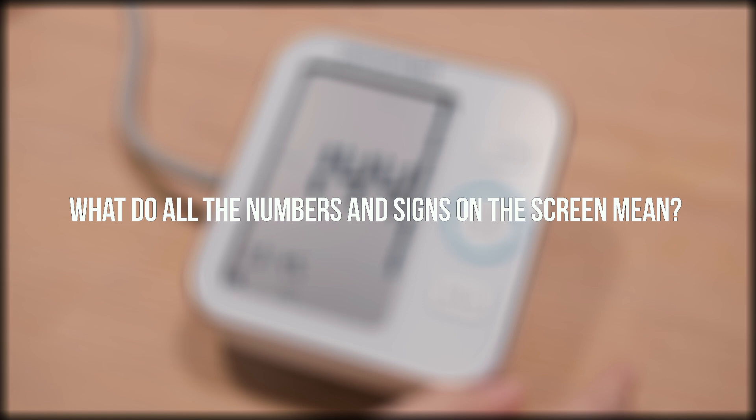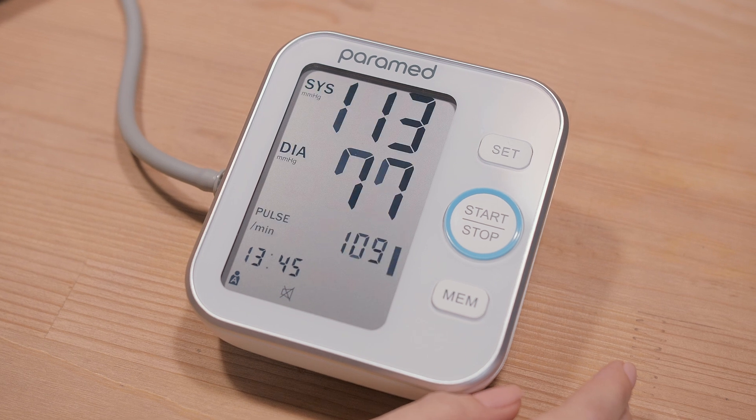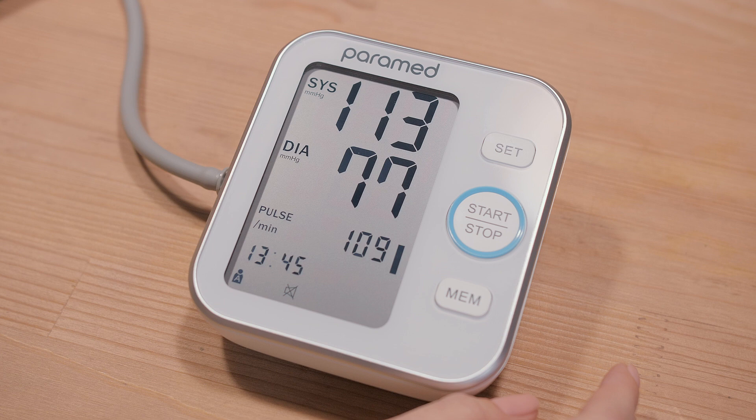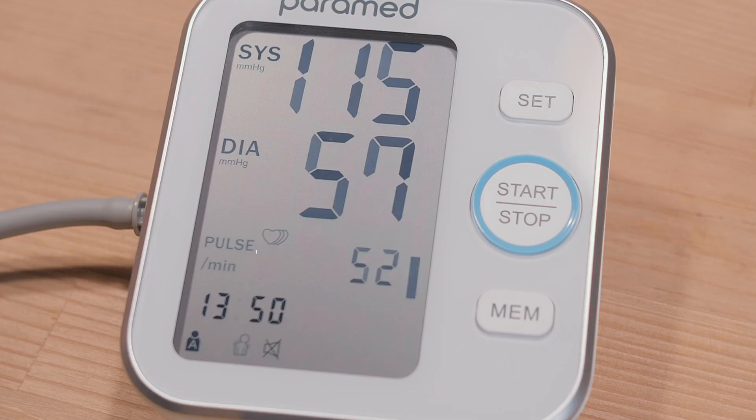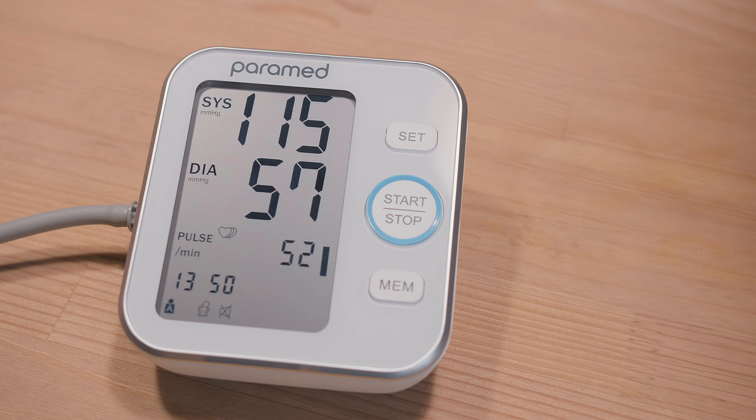What do all the numbers and signs on the screen mean? Results appear on the screen within a minute. You will see your systolic blood pressure, diastolic blood pressure, and heartbeat. If three hearts appear on the screen, this means that the device has identified arrhythmia. It is recommended that you see a doctor to have your heart checked.